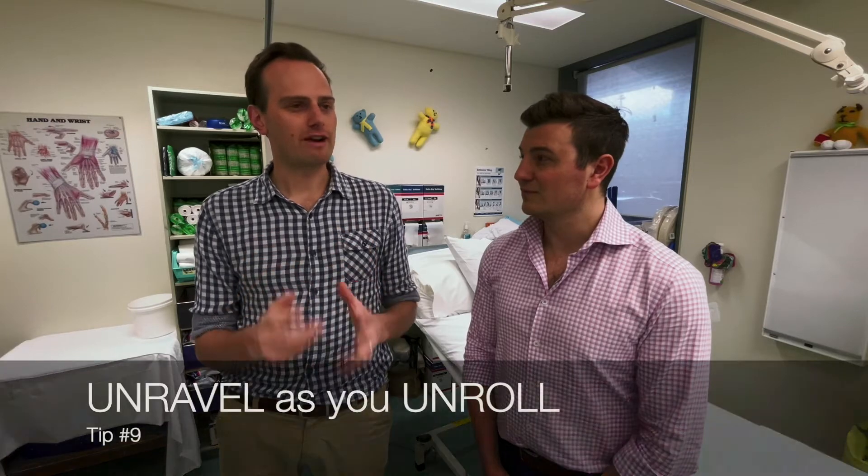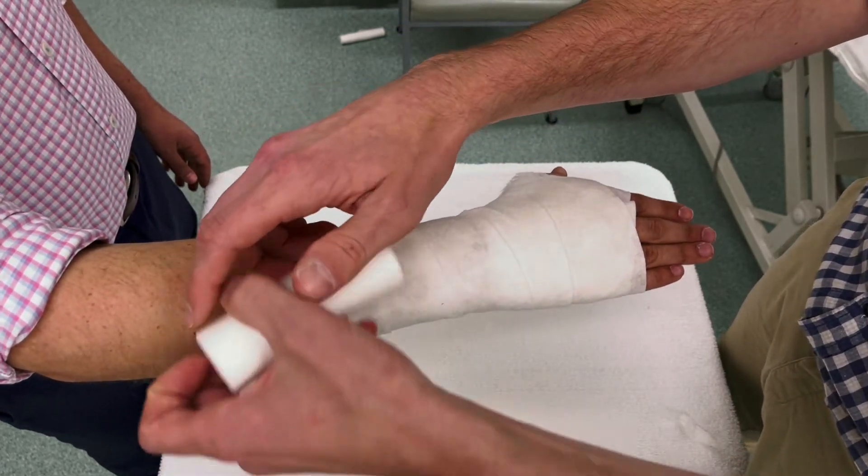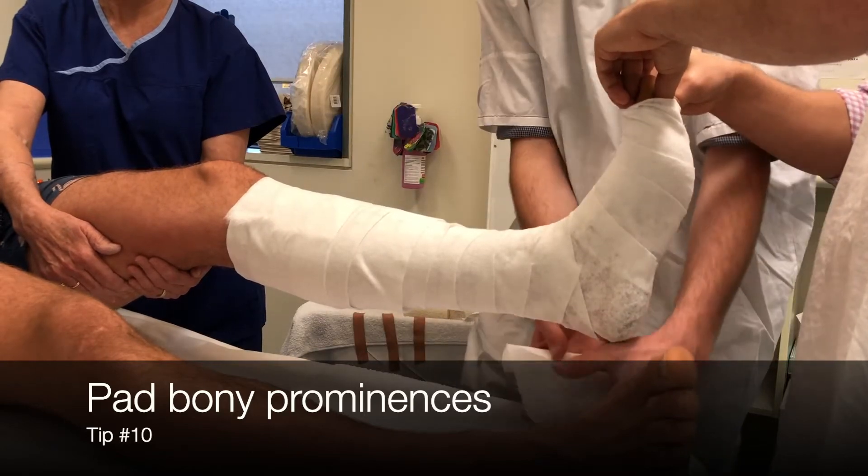In fracture clinics people might use a stocking, but in practice in theater and ED we go straight to padding. The key part is unrolling as you unroll — the roll should open up as you circumduct the limb. You don't want to be pulling and unraveling the other way, which feels unnatural and makes it very difficult. Webril is preferred as it tears easily and conforms well, unlike softband which is more space-filling but doesn't conform as well.